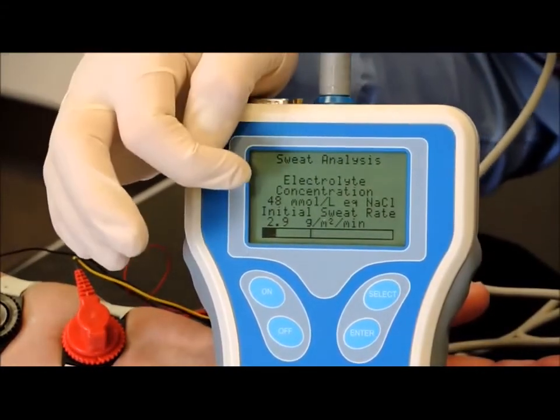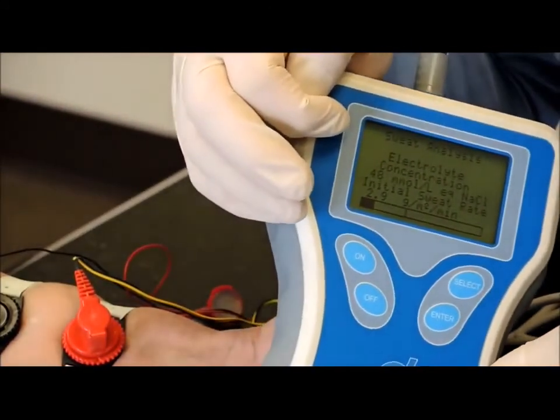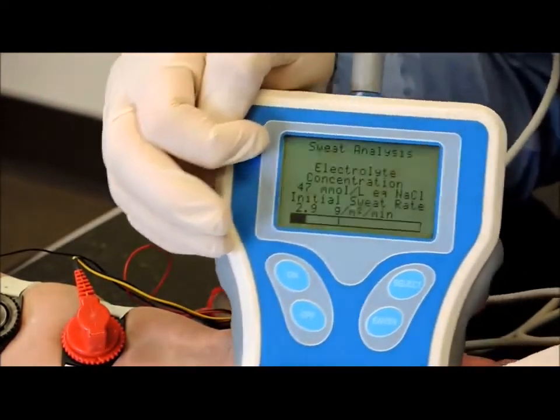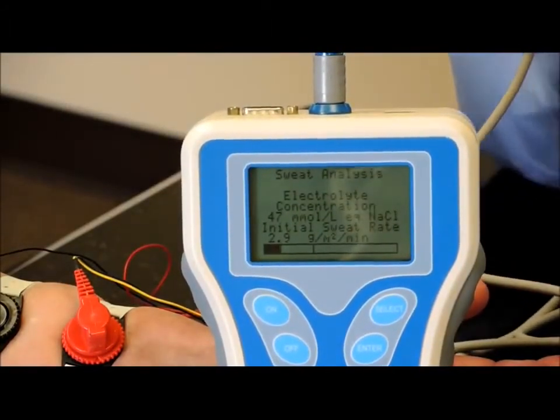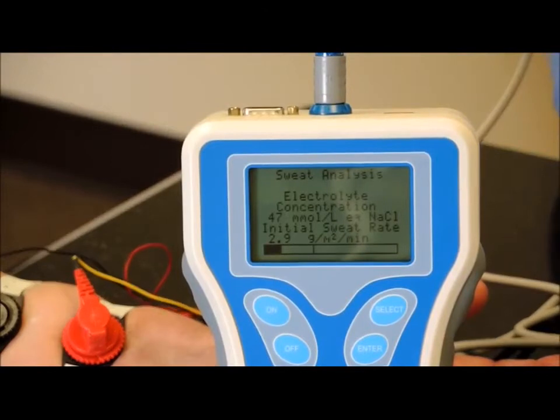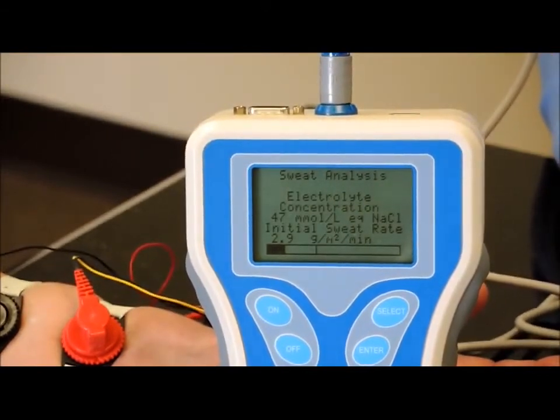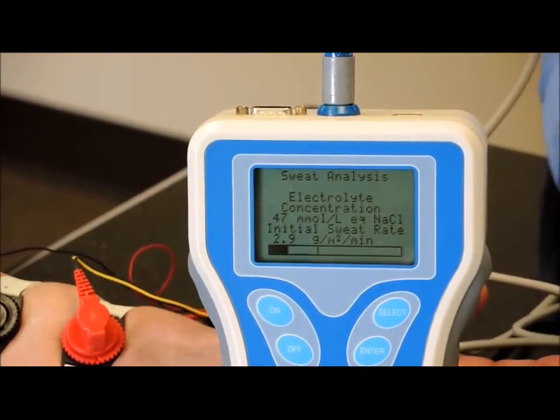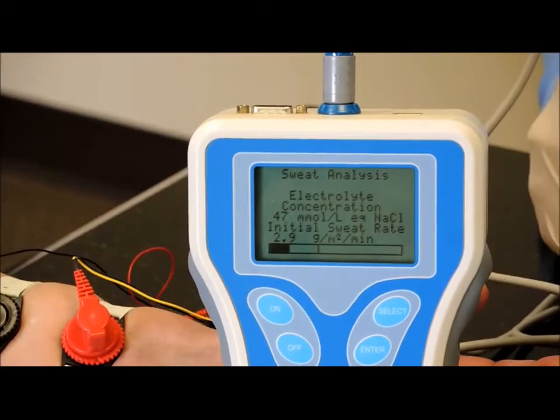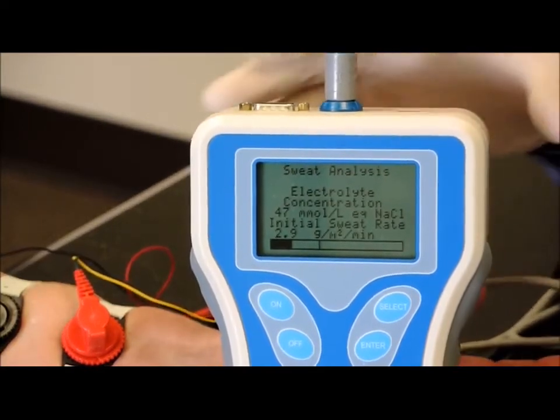Now you can see that reading, the conductivity reading, right now it's 47. Typically that reading will go down. The sweat that normally comes out first from a patient is more concentrated. It's just a biological variance that we all have, that sometimes the sweat is more concentrated with ions, and so you'll see the conductivity value be higher at first and go down.